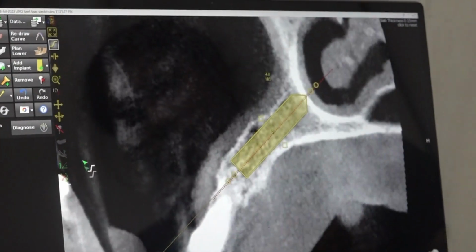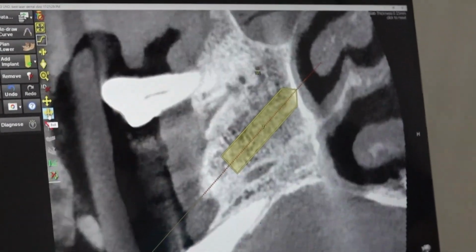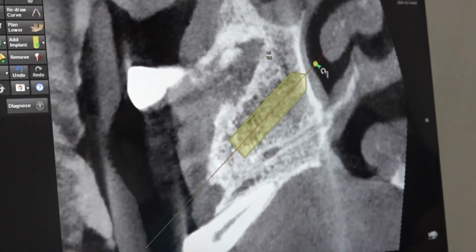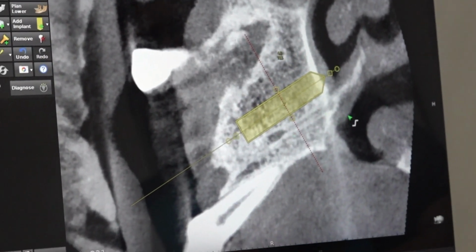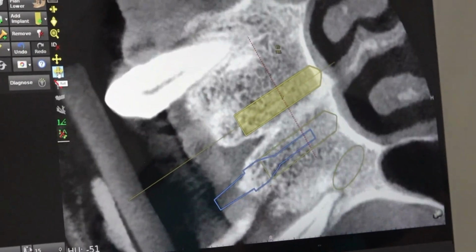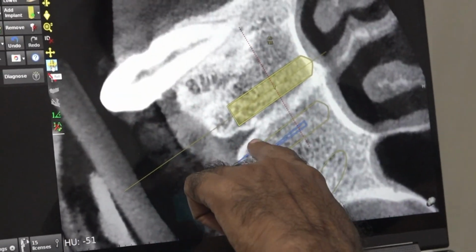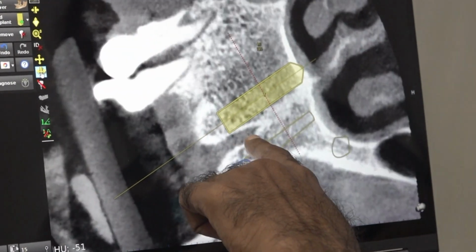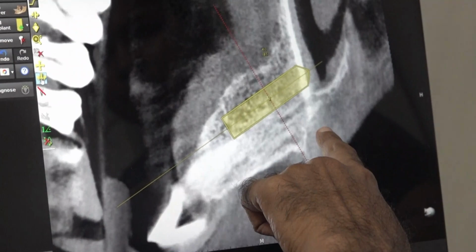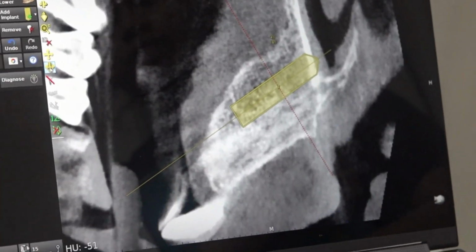Here I will see the 360 degree view. So this is the canal. We just have to avoid the canal. Can you see the canal? It is starting from here. It is going here, right? Can you see? It is going right. See here.